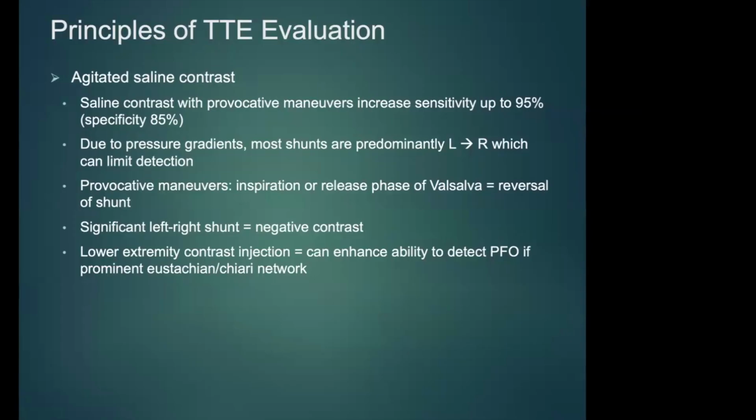With very significant left to right shunting, we see a phenomenon called negative contrast, which I'll show you on the next slide. And there's a couple of tricks in terms of where you inject the contrast that can enhance your ability to detect a PFO or a small defect.